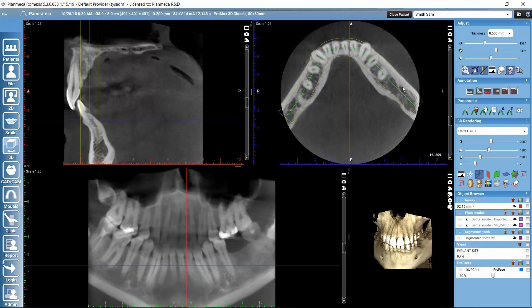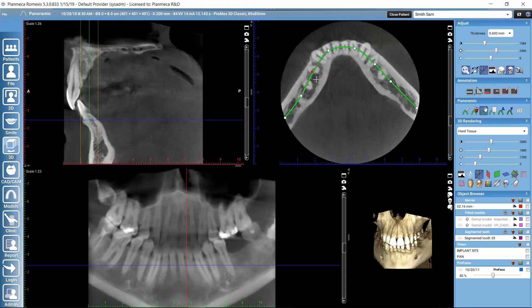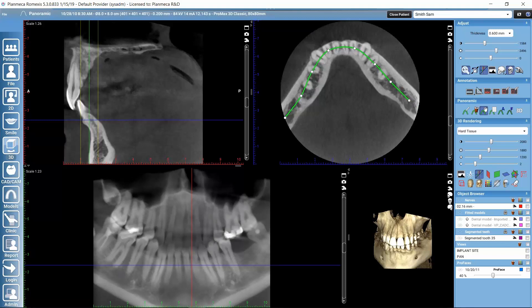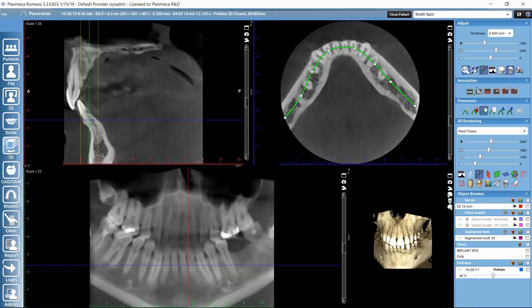Now this panoramic view got generated based on the curve we defined. If we would like to edit this curve later, we can activate the edit panoramic curve option to make it active again. The points become visible and we can grab them with the mouse to edit or drag them — for example, to make the panoramic curve shorter. If we want more detail, we can add more points in the middle. Keeping Control down on the keyboard gives us a pen-like icon to click new points or delete existing points.